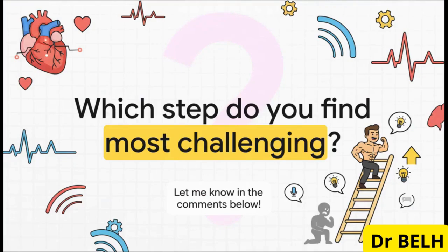You see, when you apply this 7-step method every single time, you build this powerful habit. And that habit is what replaces fear with confidence. You'll be able to pick up any ECG and read the heart's electrical story clearly and accurately.